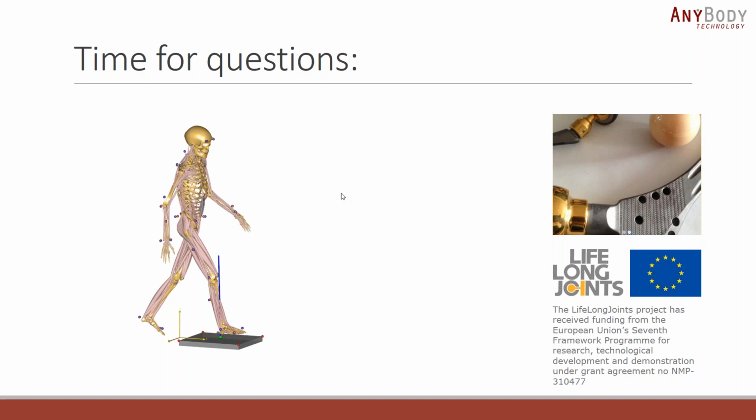Just a side question: how many of the activities that you mentioned have you actually run on the physical simulator? Is it only walking? No, so it's still just walking. But we've got a meeting with Richard in the next couple of weeks to start looking at the 24-hour loading cycle, whereby we'll be using data in the literature. I mean, there's no such thing as a typical 24-hour loading cycle, as we all differ from day to day and patient to patient. But we'll try and identify something standard that we can see in the literature and run these different activities of daily living.